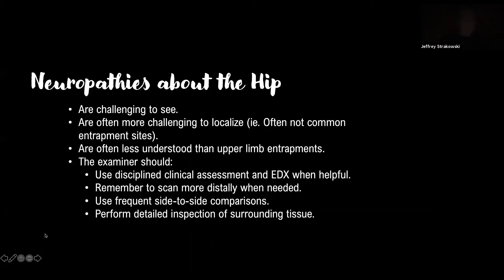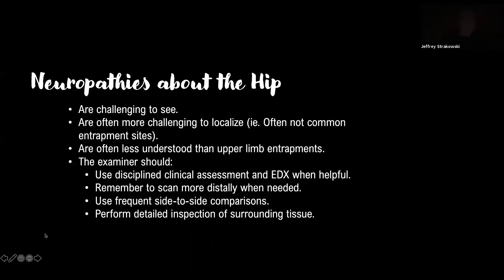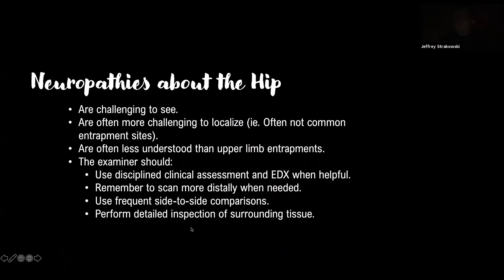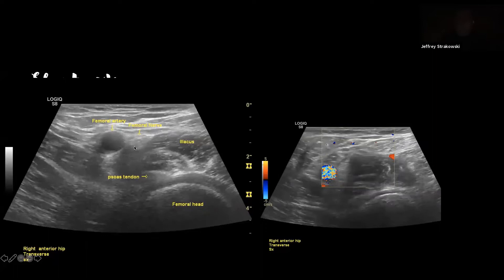This is an example of the femoral nerve. It's a little challenging to see, but we can use anatomic landmarks — the bone acoustic landmark of the femoral head, the articular cartilage, the psoas tendon, iliacus around it. The femoral nerve sits just next to the femoral artery. The femoral vein in this case is collapsed. We can look at that in short axis and use Doppler to identify vascular structures and see if there's neovascularization.